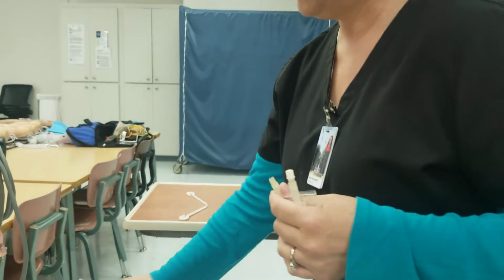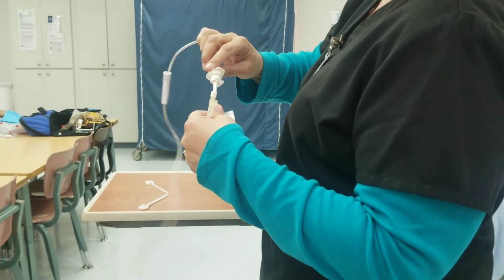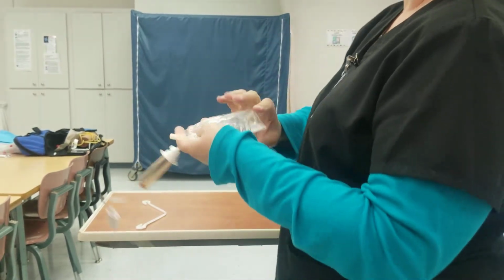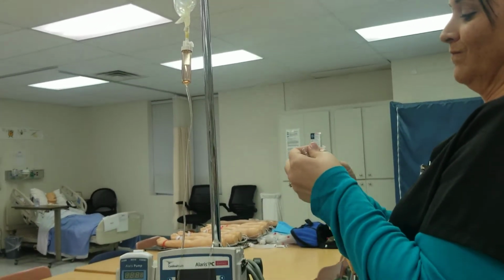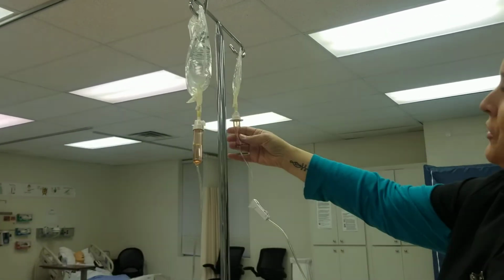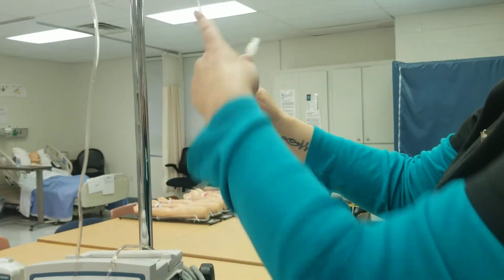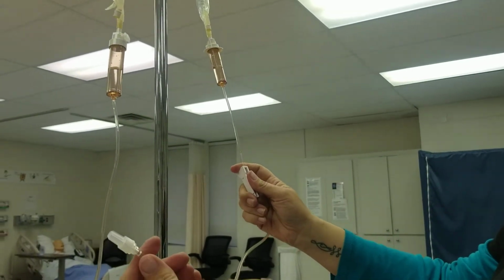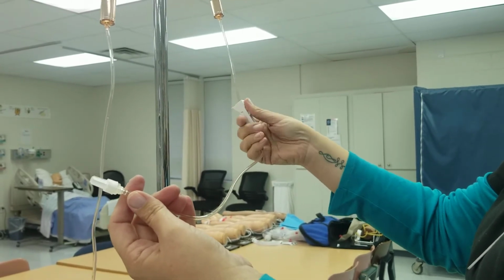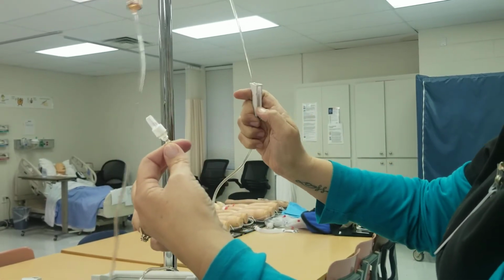So I'm going to pop that off. Make sure I don't touch the end. Same thing with the spike right here. Squeeze it down on there. Got my clamp closed. I'm going to hang it up. We squeeze our drip chamber. Now we need to prime the line. We're going to open that up. You can watch it, see how it comes down. And we don't want to waste any of the medication, so you want to be careful, go slow, maintain control. Boom. All right.